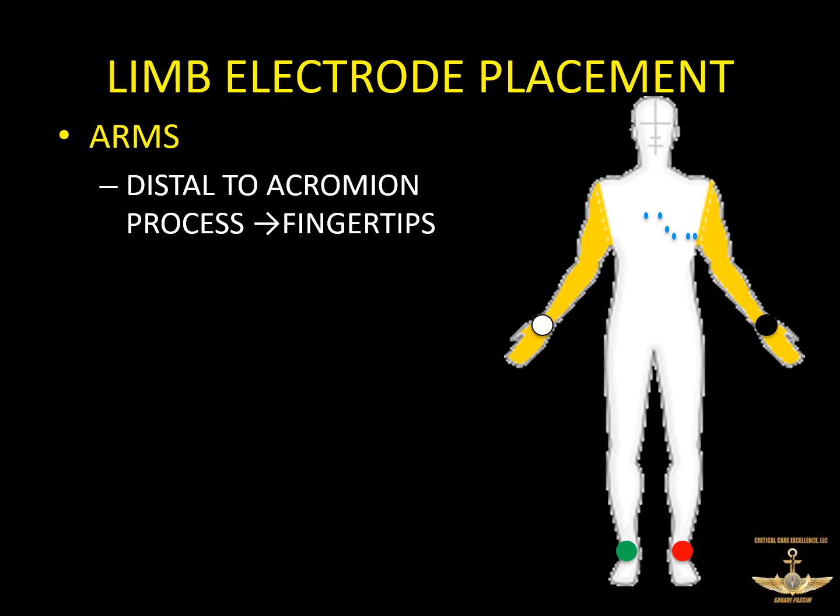And if you tell somebody to lay still, they'll put their arms down by their side, and that becomes a fairly stable recording point.